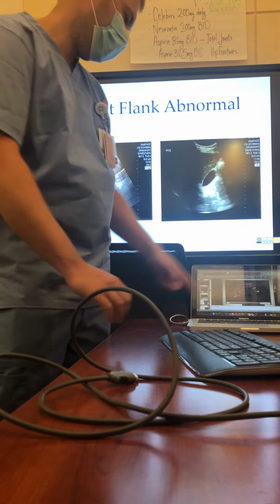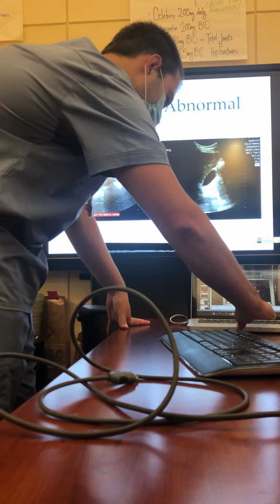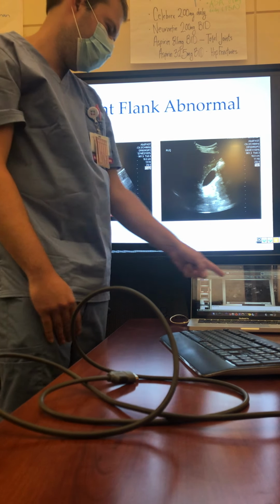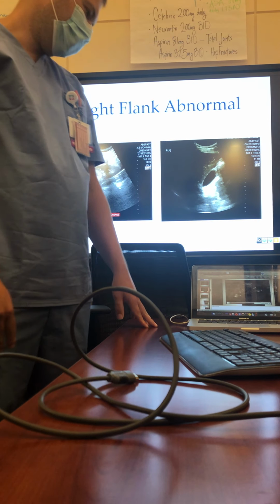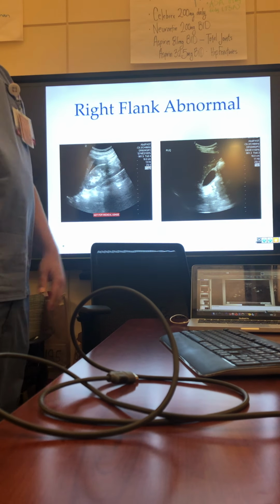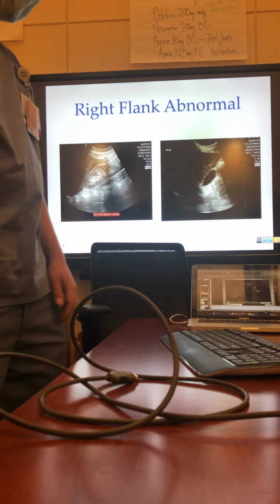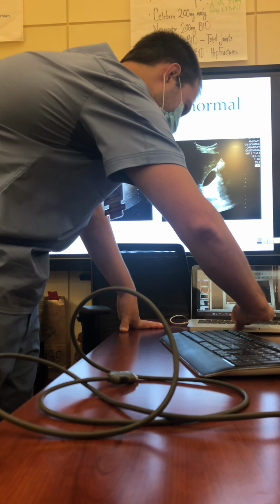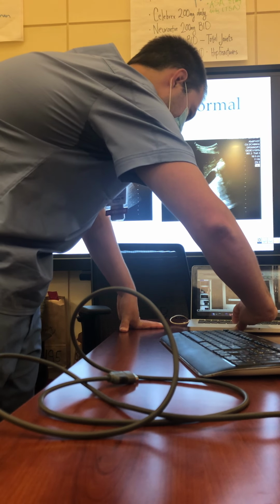Yep, you can actually see at the very end there, you can see the liver kind of flapping a little bit in the fluid. See that up here? Yep. So it's basically submerged in fluid, so it's moving around a little bit. Sorry, I know this is gonna be annoying for you guys.